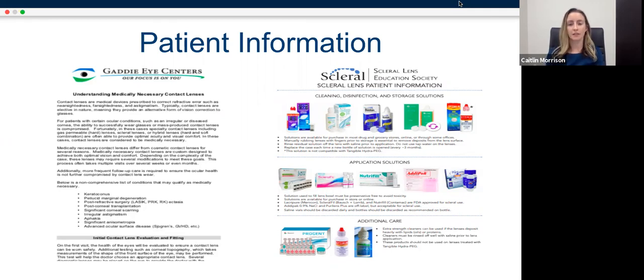So basic supplies, I mean, the fluorescein you already have. So pretty easy stuff that I honestly got most of it on Amazon when I was first starting out. And now I have other ways of getting it, but got it on Amazon at first. And then when each patient comes in, we'll go over a scleral lens agreement, which is a patient information form. The agreement will go through our 3 months of being together, the warranty period, what we're going to be doing, what happens if a patient wants a refund, how much the procedure and lenses are going to cost them, and then some information about sclerals in general, and then they sign at the bottom. So we're all in agreement about everything moving forward.